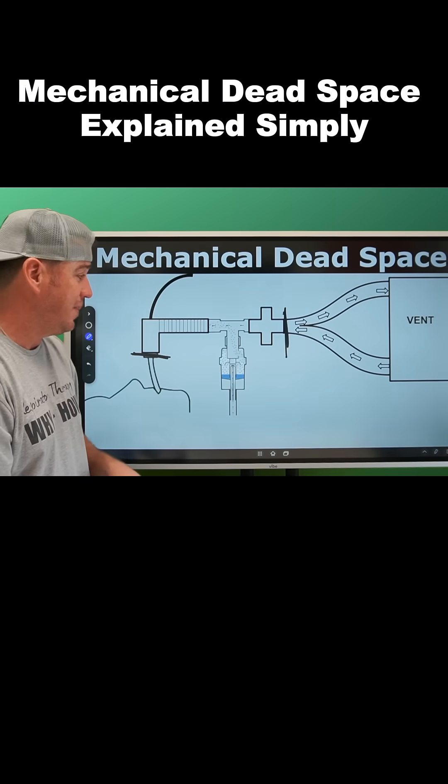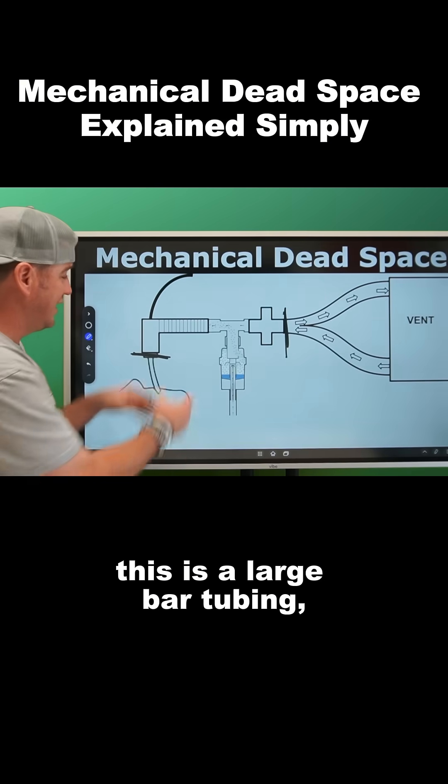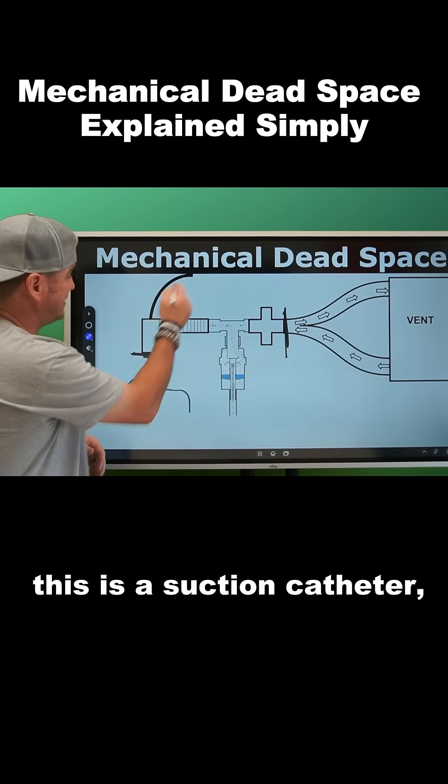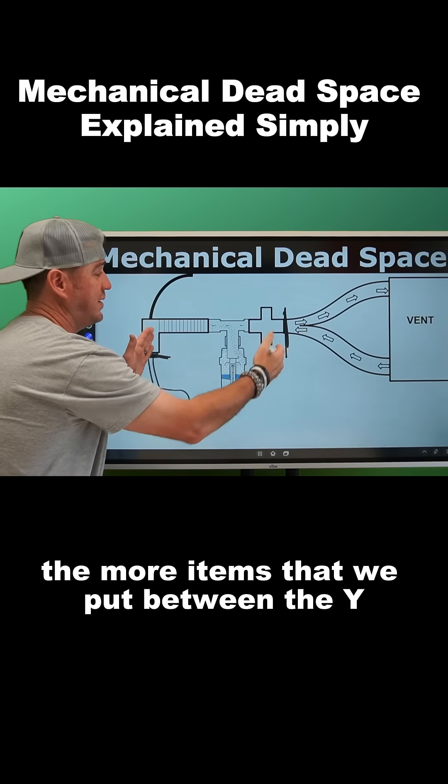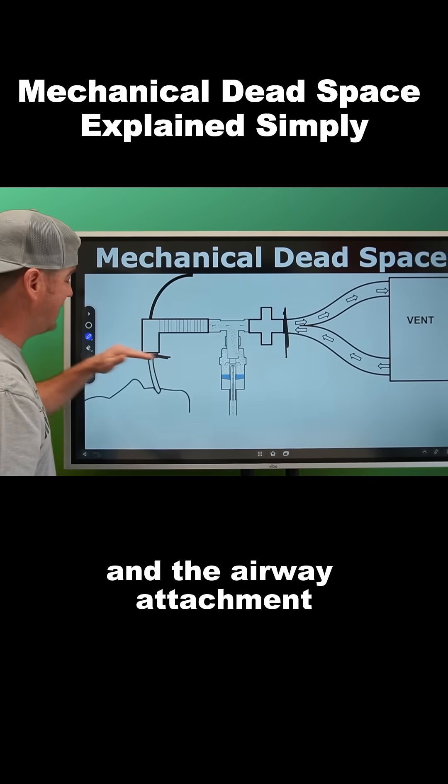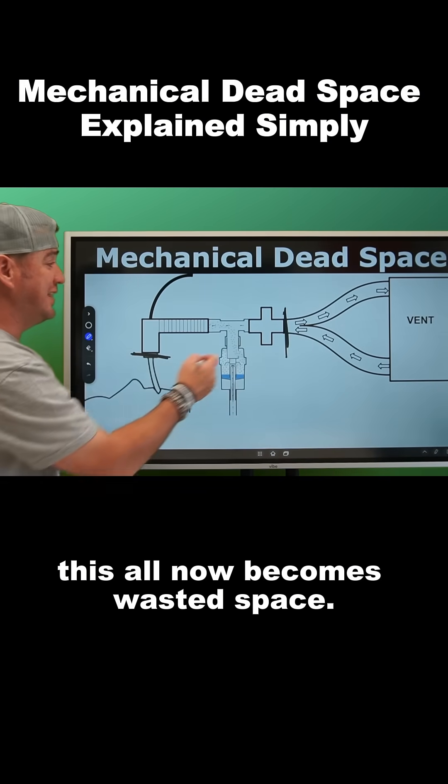This resembles an HME, this is obviously a nebulizer, this is large bore tubing, this is a suction catheter. What we see is that the more items we put between the Y and the airway attachment, this all becomes wasted space.